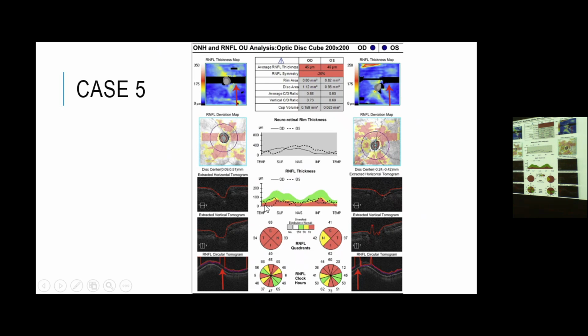These parameters, and the thickness scale, the thickness curve, there is thinning in all the quadrants. Okay. And the rim area, this area, they're all colored in gray. This ratio is 0.88, 0.8. Significant for glaucoma.